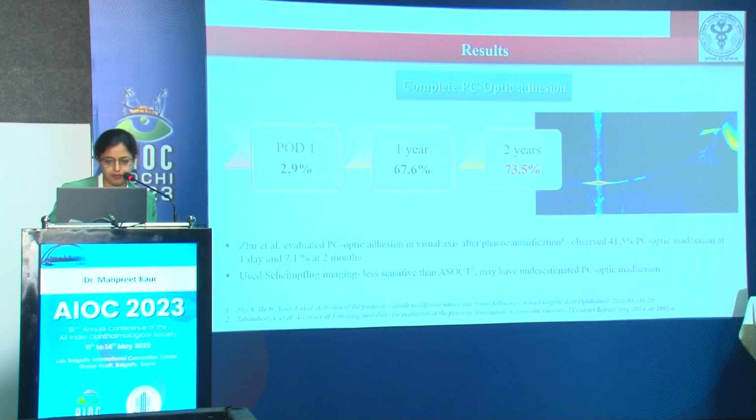96 microns was left. So on postoperative day 1, only 2.9% cases had complete PC to IOL optic adherence. At 1 year, this figure increased to 67.6%, and at 2 years, 73.5% had complete PC IOL optic adherence. That means nearly more than 1/4 cases still did not have complete adherence.